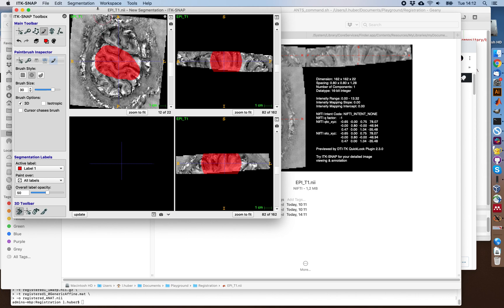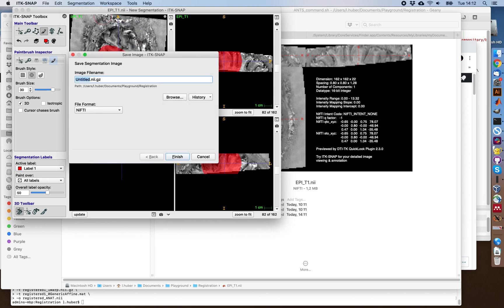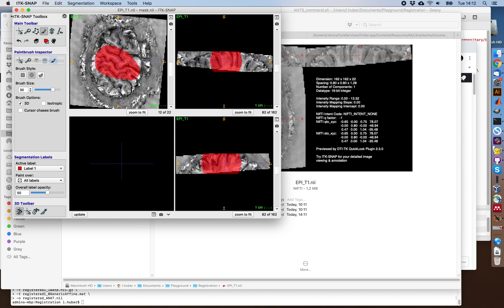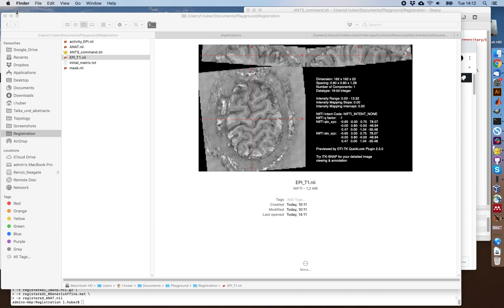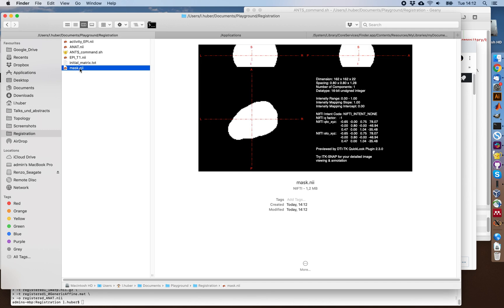And this then can be saved as a mask, for example, by save segmentation image. This is just a manual transformation that we did and mask image, which is basically this binary image telling ANTs later which area to focus on.